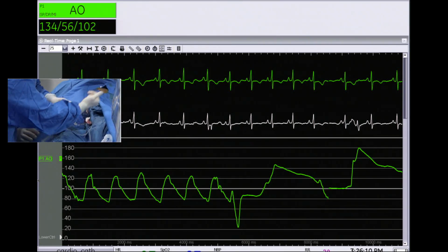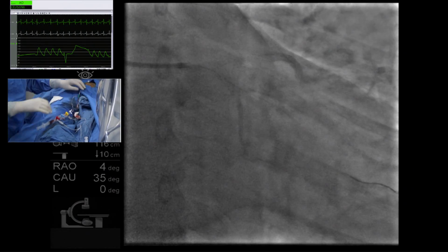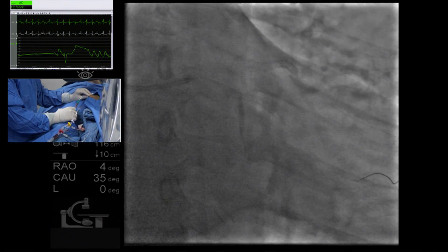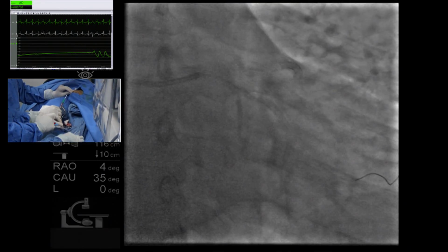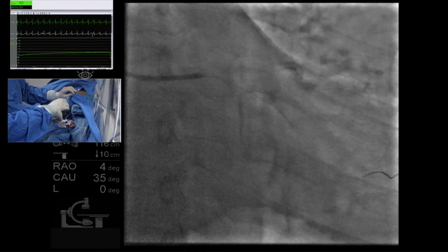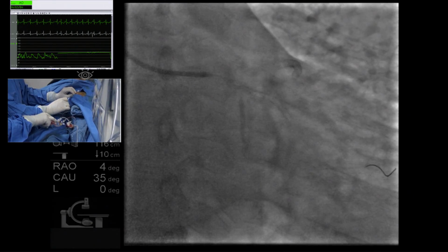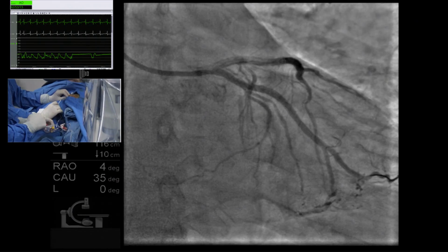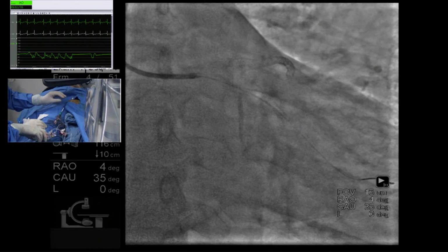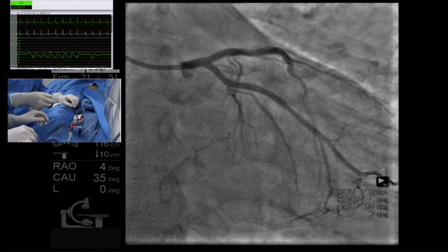Okay, perfect. Yeah, that will be better. Perfect. Puff there. See if we're engaged. No, maybe counterclockwise a little. Perfect. There. That fits. Wow, beautiful. We get an Academy Award for this one. So let's OCT.